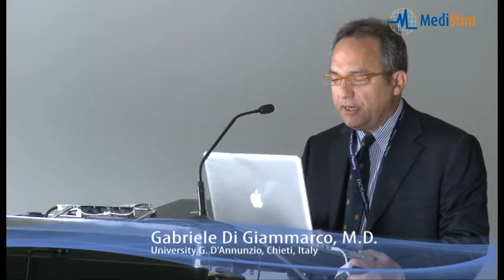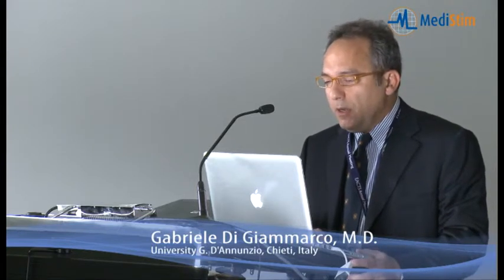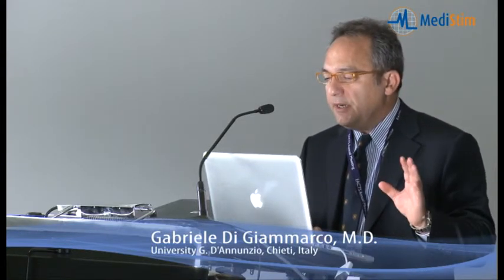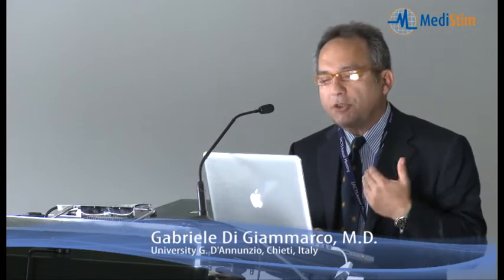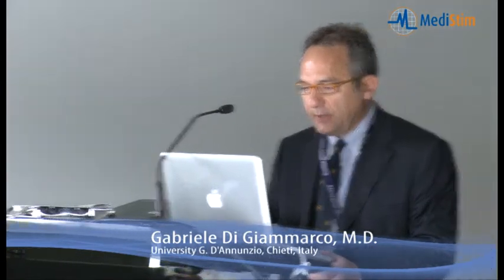Look, this is the LIMA. This is a transverse section. Look, it's full of thrombi. But the LIMA was still functioning up to 4 centimeters from the anastomosis. So we decided to cut the LIMA and reuse it for a new anastomosis proximal to the previous site.